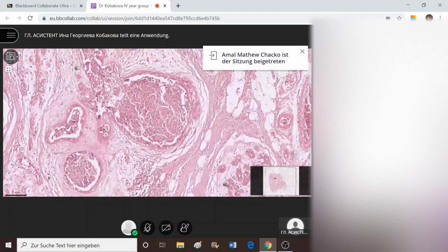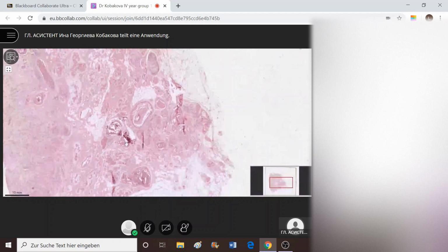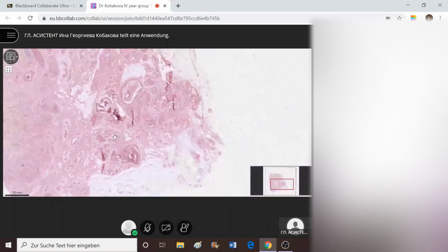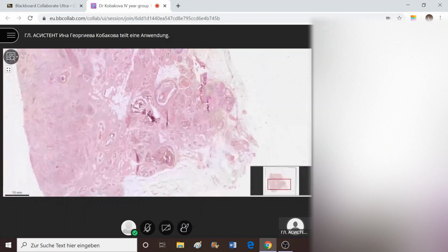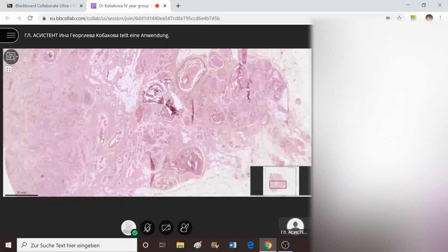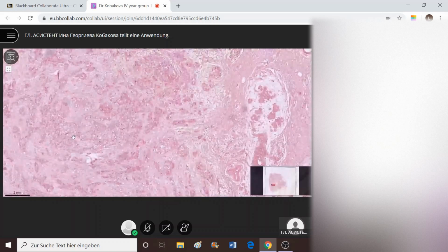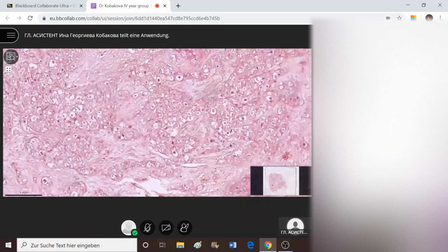Later, what we observe here, or why do we call it infiltrating? Because we see multiple of these nests of cells which are looking compact and attached to each other, and they will lose this attachment if it's a lobular type of carcinoma, but this is a ductal one. So this attachment appears here again. Although they look like compact clusters of cells, they pretty much stay together.